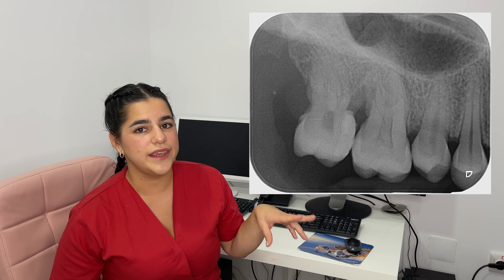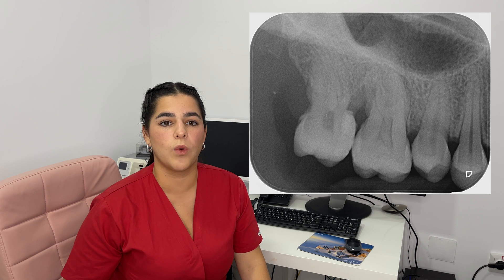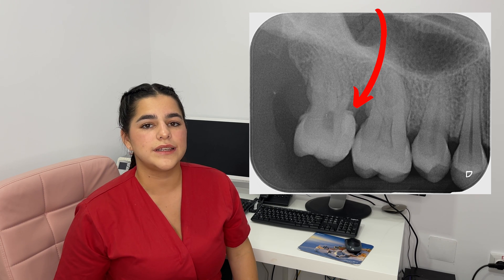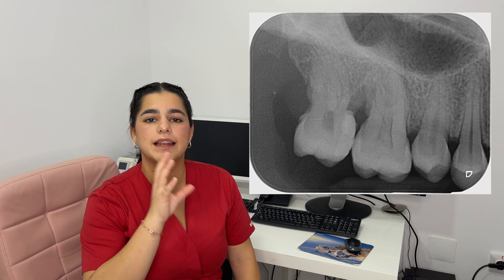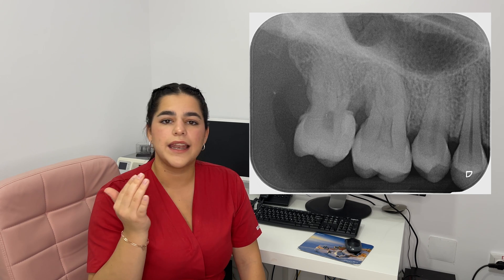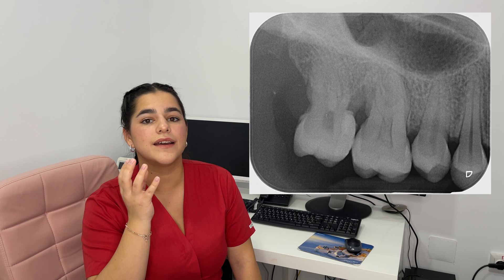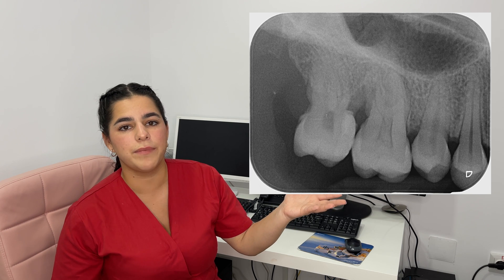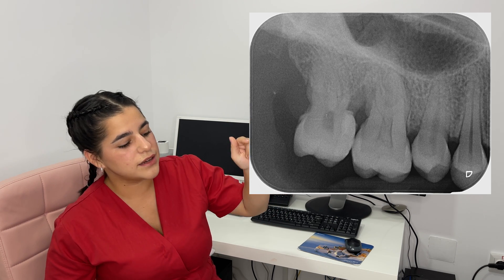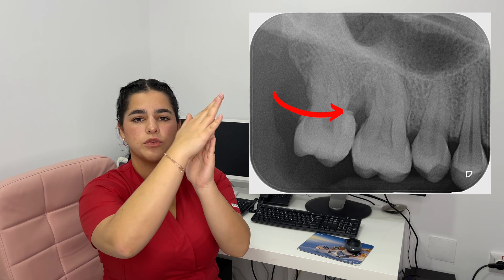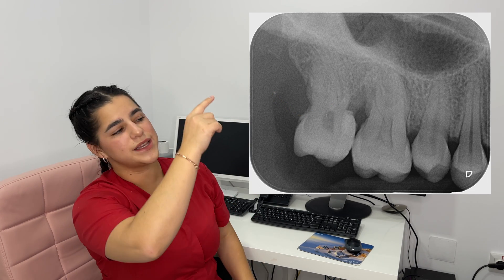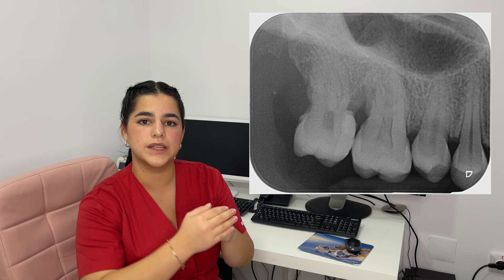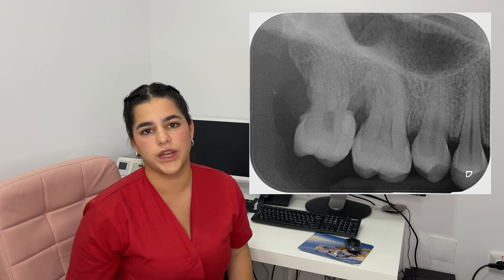In this image you can see tooth 1.7 with an obturation that was done incorrectly — what we call an overhanging or 'balcony' restoration — which resulted in inflammation of the patient's gum. In the mouth, everything looked very proper with the restoration, but the gum was inflamed around this tooth. So I requested an x-ray, and we can see the obturation is in overhang — it creates a little L-shape here. Normally it should be smooth and follow the tooth line, but it sticks out. It has to be removed, the matrix repositioned properly under the gingiva, and the obturation redone.